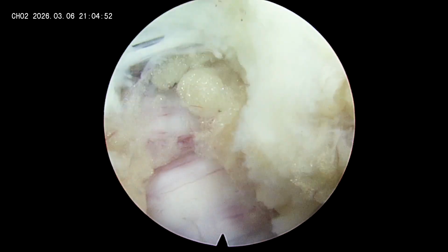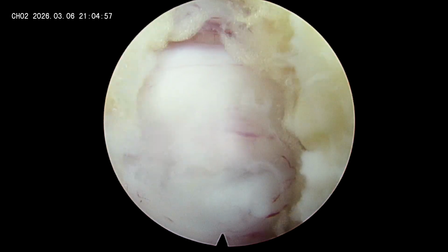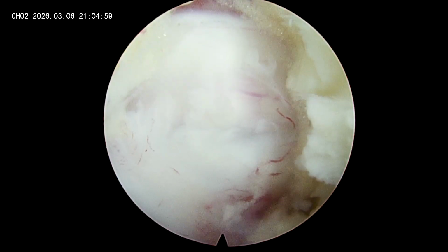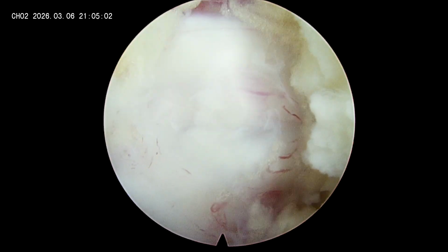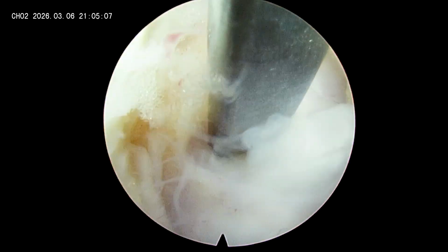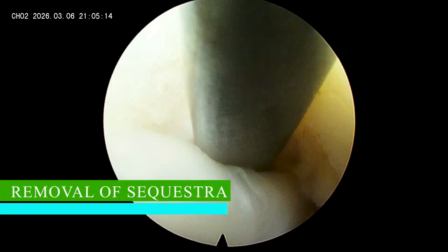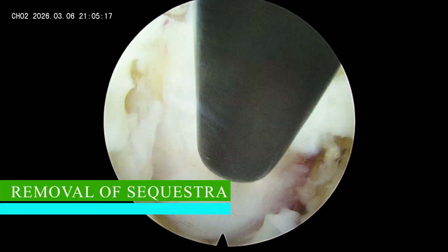On the medial side, you can see the dura and the fat coming from the opposite recess. Here we are not going to go to the opposite side. Our intention is to do just the discectomy and finish the surgery. So I'm just teasing out this disc fragment from underneath the root.